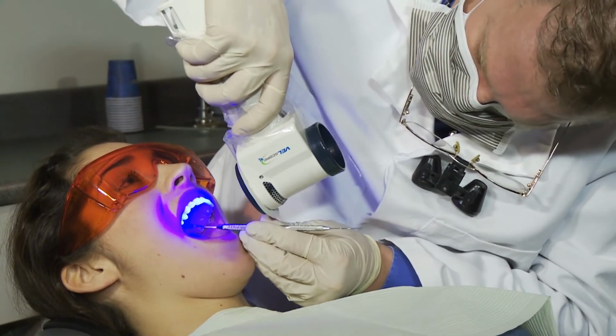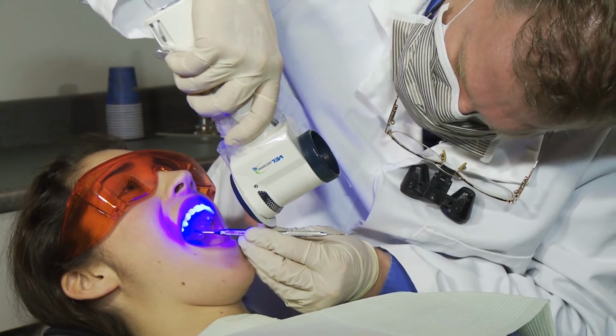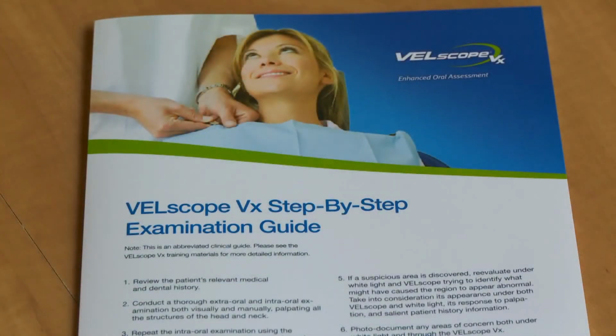Fluorescence is typically lost in areas of inflammation. If fluorescence returns when you compress the tissue, there may be an inflammatory component to the lesion. It's important to note, however, that dysplasia can also be accompanied by inflammation. If a lesion does not completely blanch when compressed, heightened observation and follow-up is warranted. For a comprehensive discussion of tissue under diascopic pressure, please refer to the training materials provided with your system.